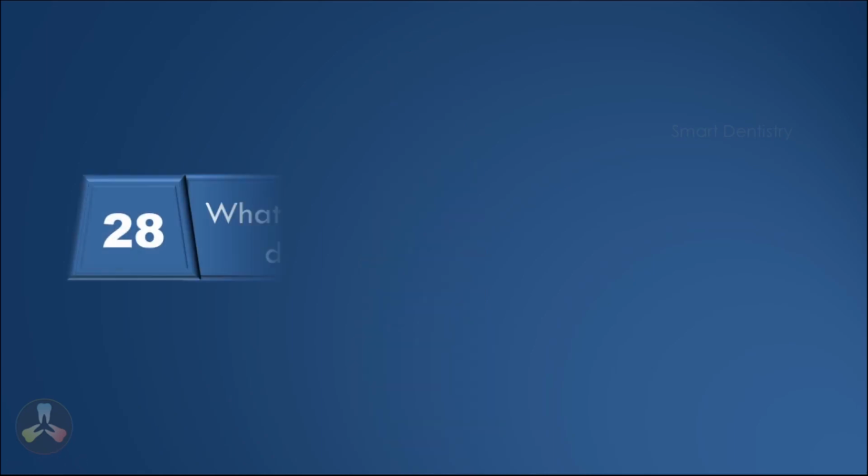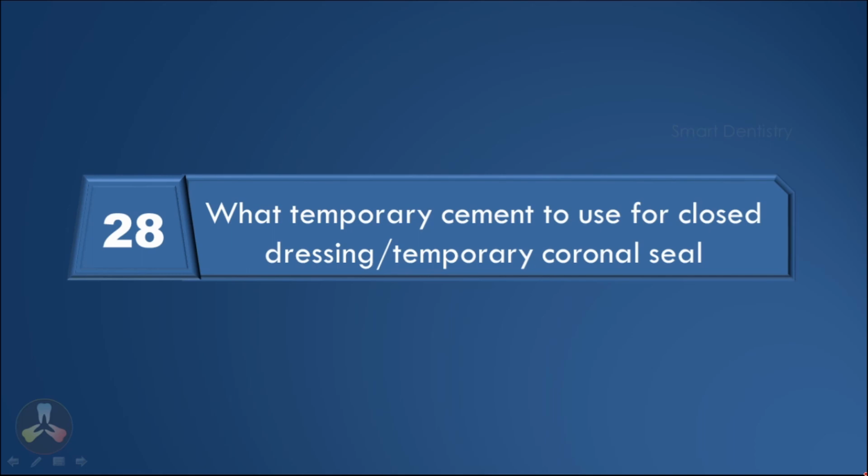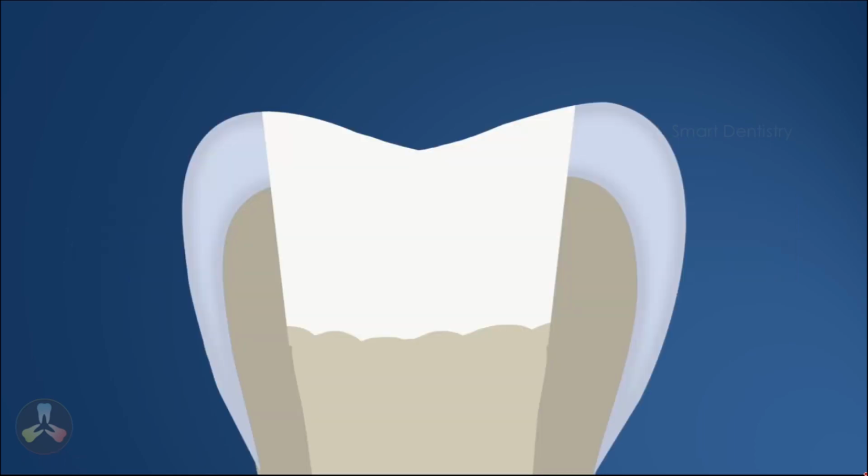Tip number 28. After preparing the access, cleaning and shaping, and if you are planning to give an intracanal medicament and send the patient back, we have to place a temporary restoration. Or after doing root canal treatment, we will be sealing the access cavity with a temporary coronal seal. So what temporary cement can be used for giving this closed dressing or a temporary coronal seal? From my point of view, zinc oxide eugenol cement remains as one of the wonderful materials for giving temporary restorations.